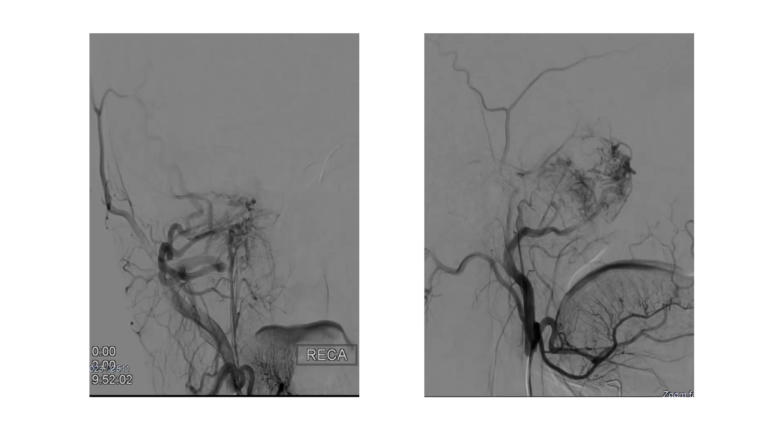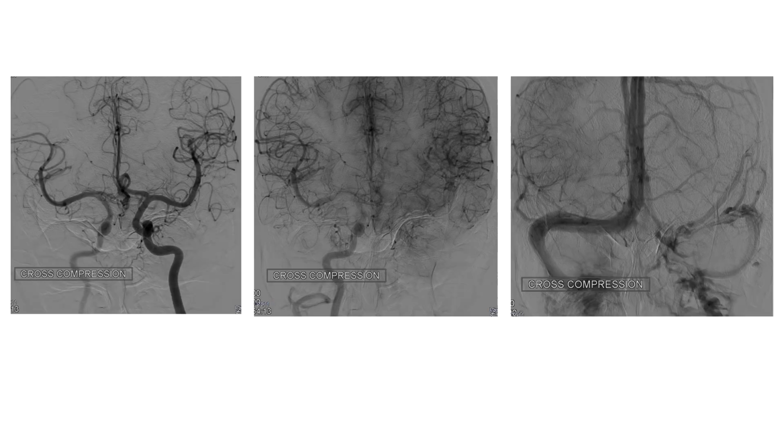This is the external carotid artery injection. We can see a large part of the tumor being supplied by the external carotid artery. This is the ascending pharyngeal, and this is the internal maxillary artery.